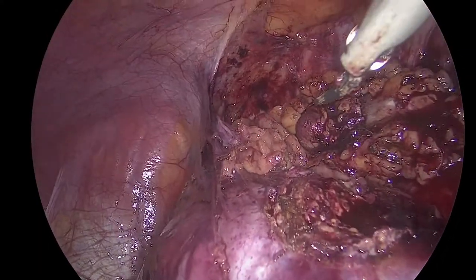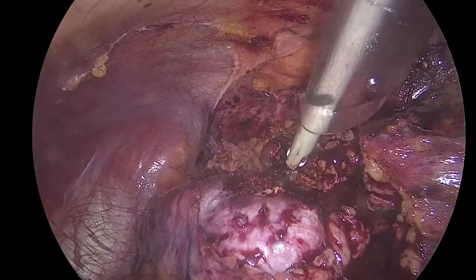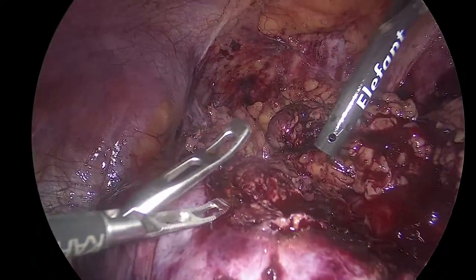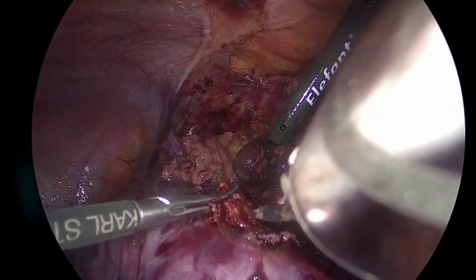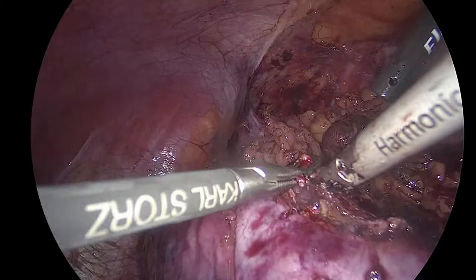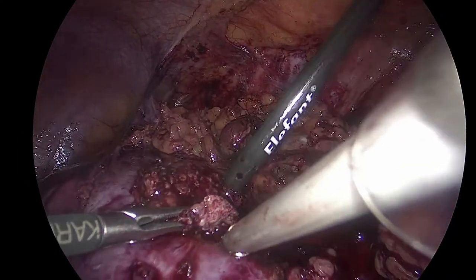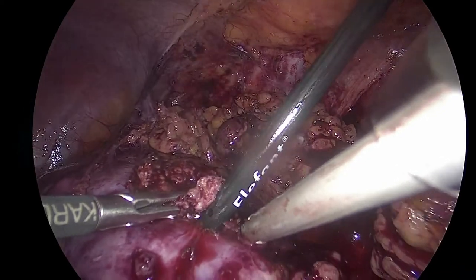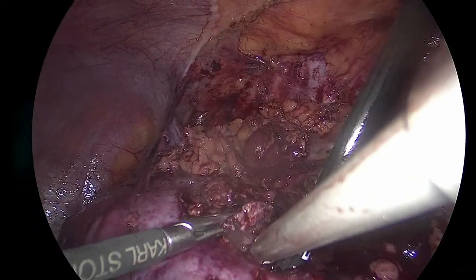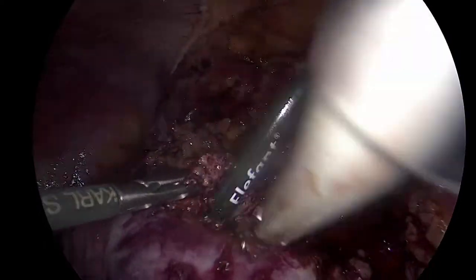Take the suction here, and I want you to aspirate the smoke. Show him. Here. You aspirate. Give me a grasper, please. Good. Yes. Come in. Good. Stay there. Show me left, left, left. Show me here. Aspirate inside. Good. Put some tension there for me. Yes. Good. Tension here for me. Here.